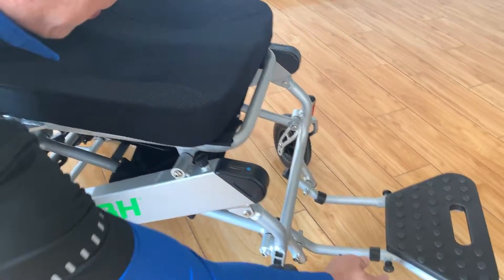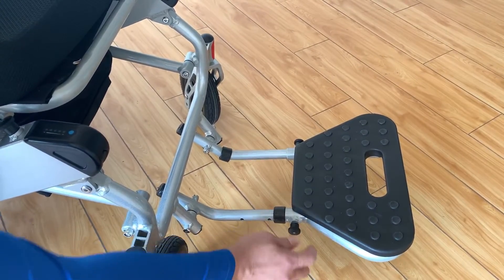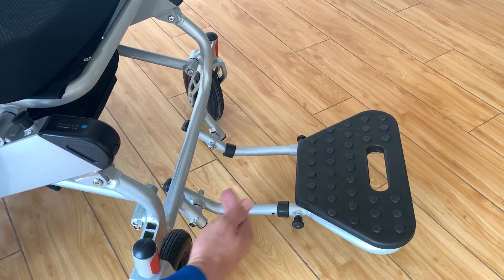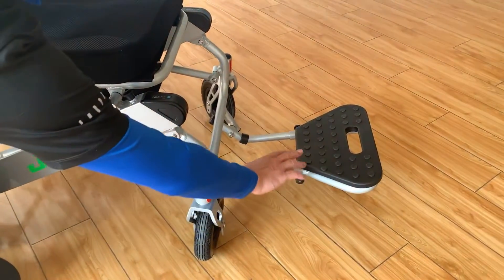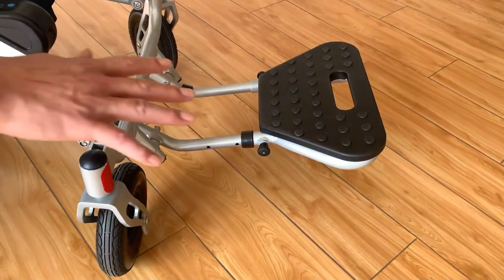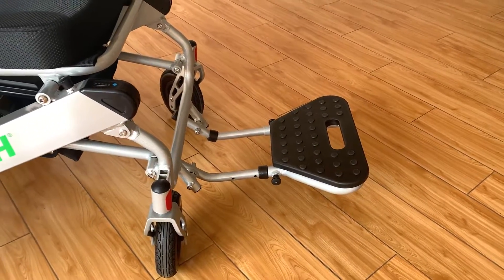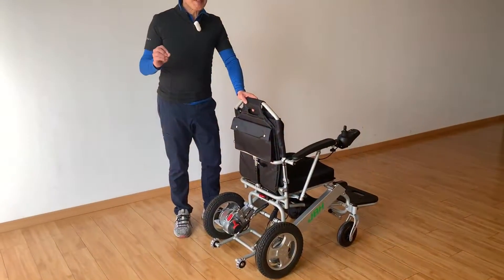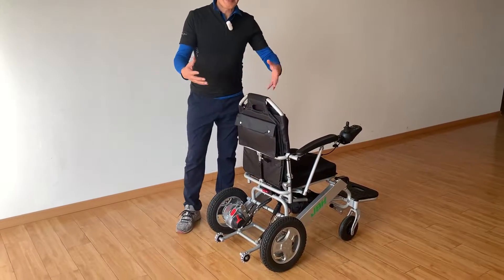For the footrest, you can adjust the length depending on the leg length of the user. It's very simple and easy. It also has anti-slip spots on top — these are really good features.